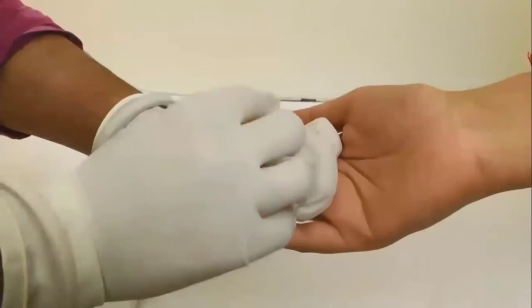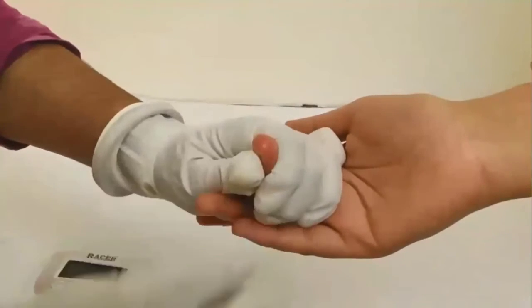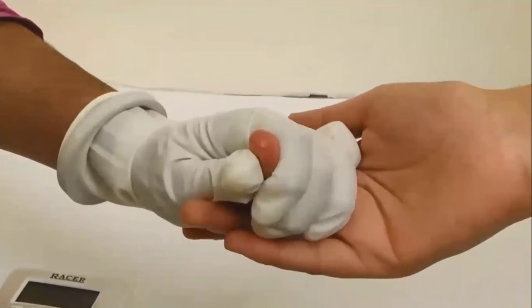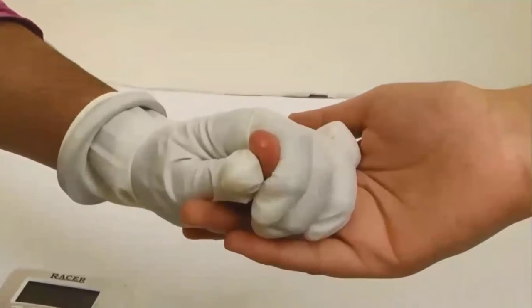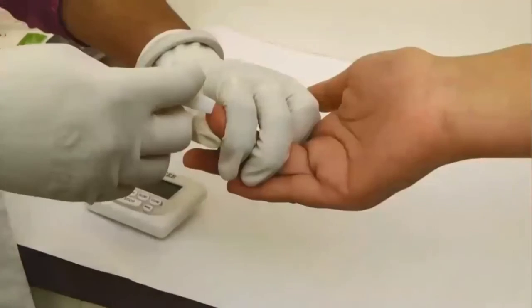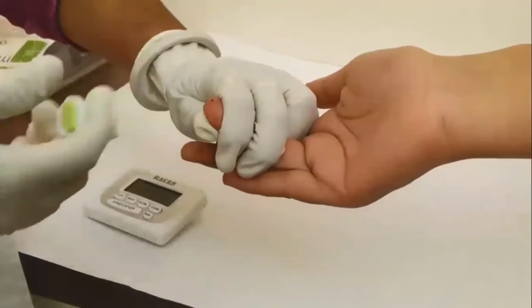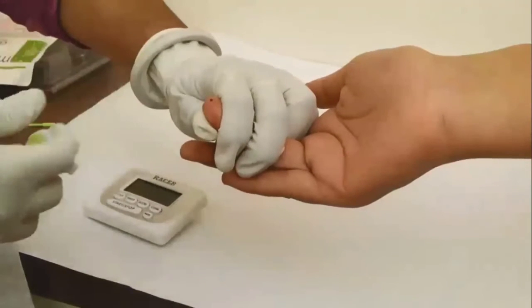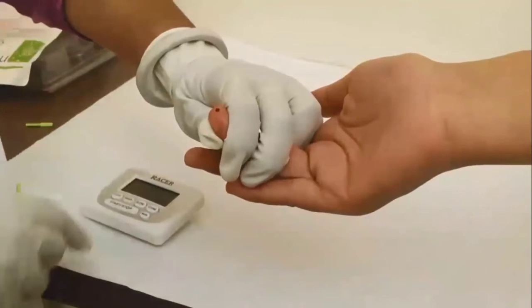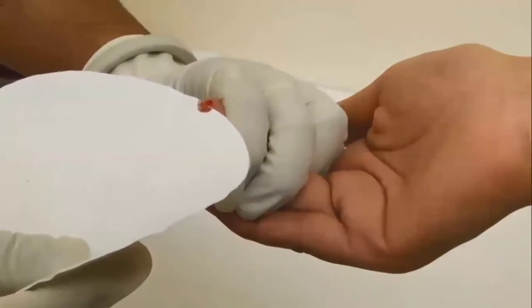In the Duke method, the tip of the finger is cleaned with the spirit swab in order to avoid infection. Then, with the help of a sterile lancet set, a 3 mm deep cut is made on the tip of the finger. As soon as the bleeding starts, the stopwatch is started.